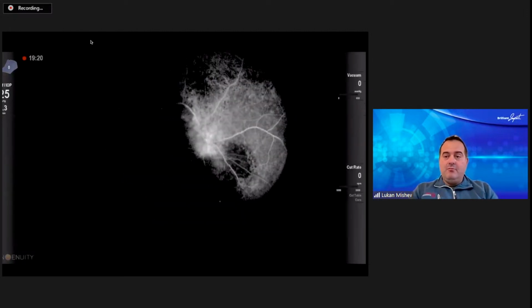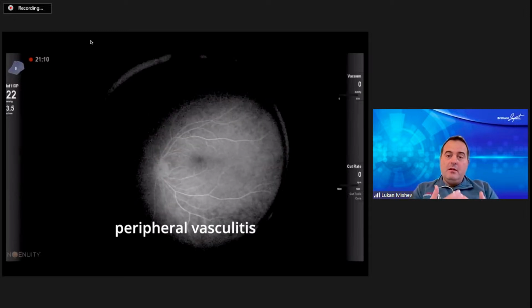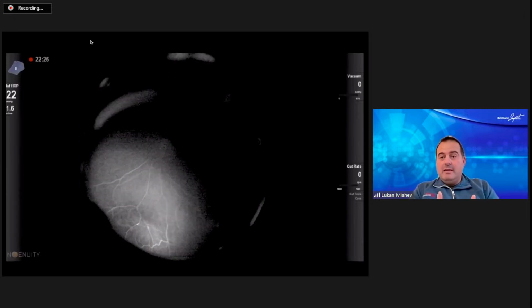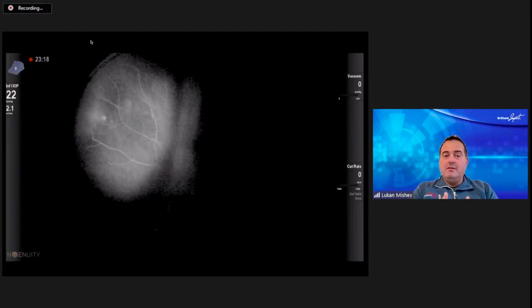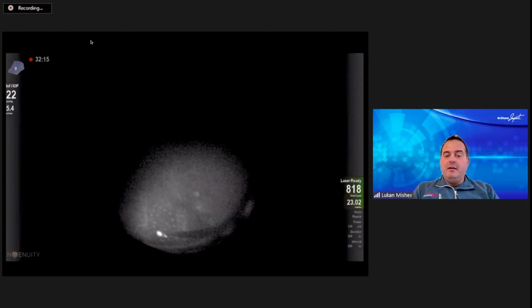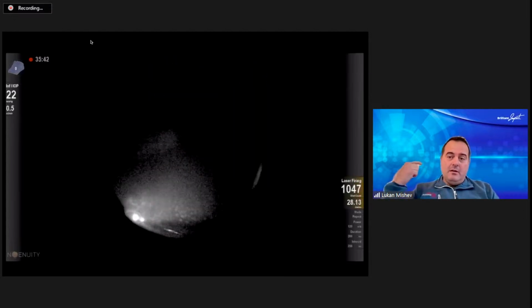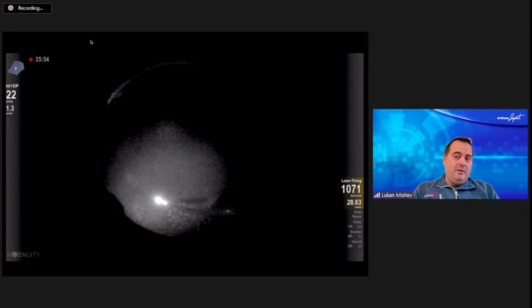On the other hand, we might assume that we can treat it with rTPA or anti-VEGF and things like that, and we have a basis for that, which is our intraoperative angio. This is another case where it was a long-standing hemophthalmos, and after we cleared the hemophthalmos, we did a fluorescein angio because at first glance in the posterior pole, there was nothing wrong. And we saw that it is a peripheral occlusive vasculitis with small points of leakage, as you might see. Also, you see interrupted vessel flow here, empty vessels. So we performed the intraoperative fluorescein-guided endolaser, which makes the Ingenuity not only a visualization, but a diagnostic and navigational system. So we are beginning to look a bit like the neurosurgeons, which I really like, actually.